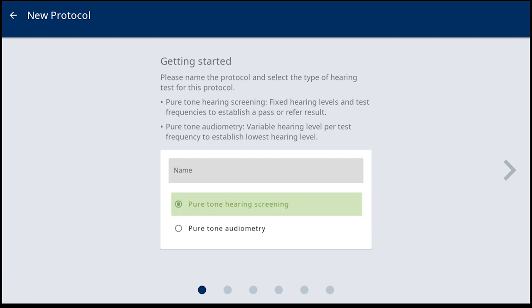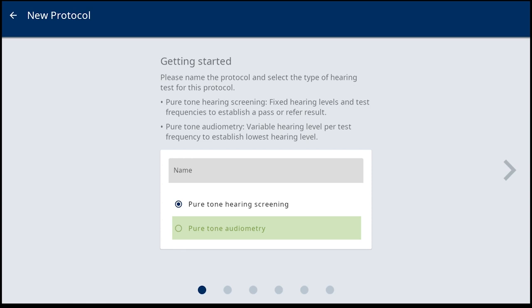PureTone Hearing Screening offers the sweep screen approach, and PureTone Audiometry includes the level adjustments within the test screen.